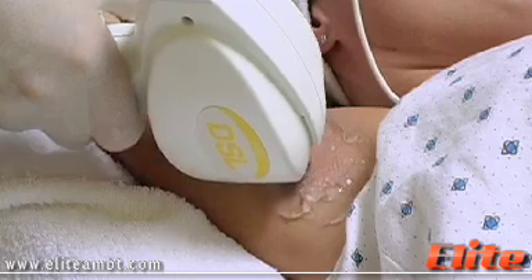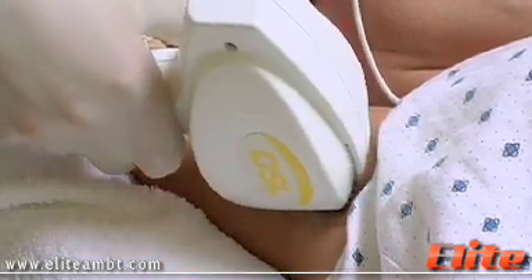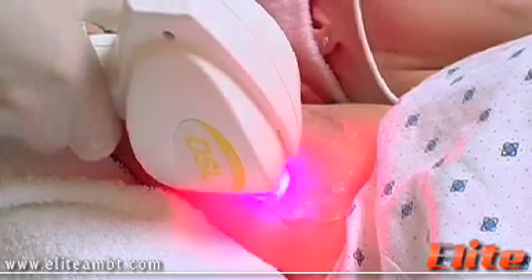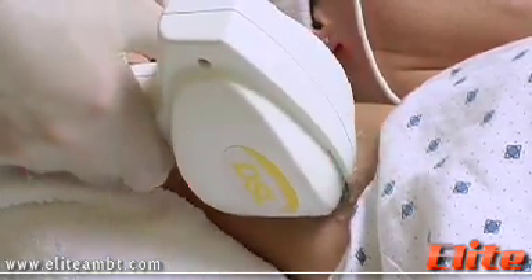What we're doing today on the armpit is two passes. First we cover the whole area with one pass and then we will follow through perpendicularly with a second pass in order to remove the hair follicles in that area.